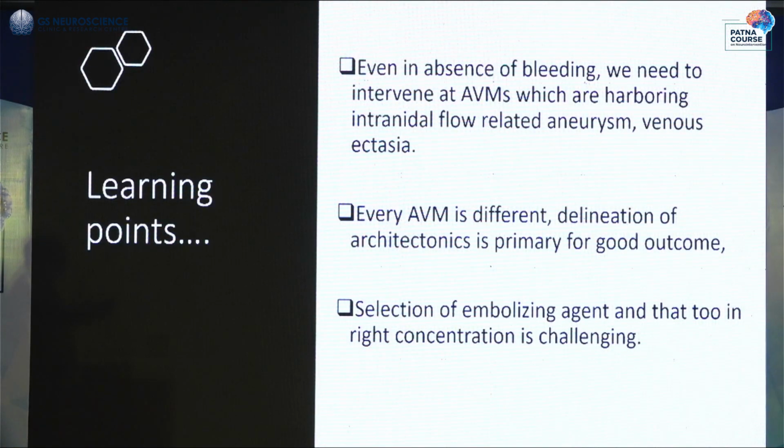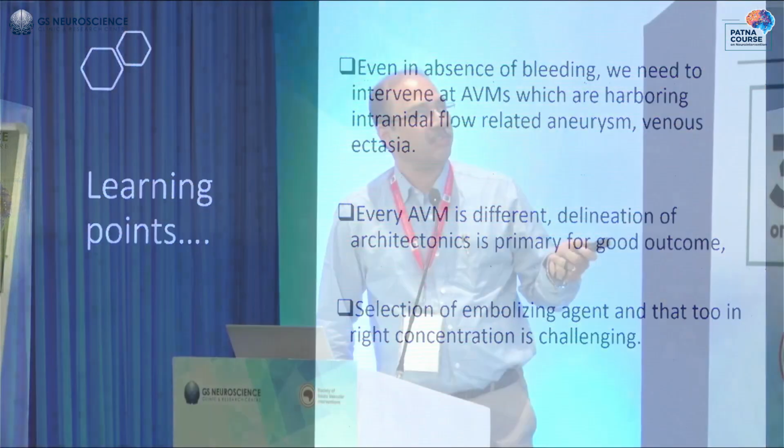So take-home messages: even in the absence of bleeding, we need to intervene in AVMs which are harboring intranidal flow-related aneurysms and venous ectasias. Every AVM is different, and selection of embolizing agent, and that too in the right concentration, is challenging. Thank you.